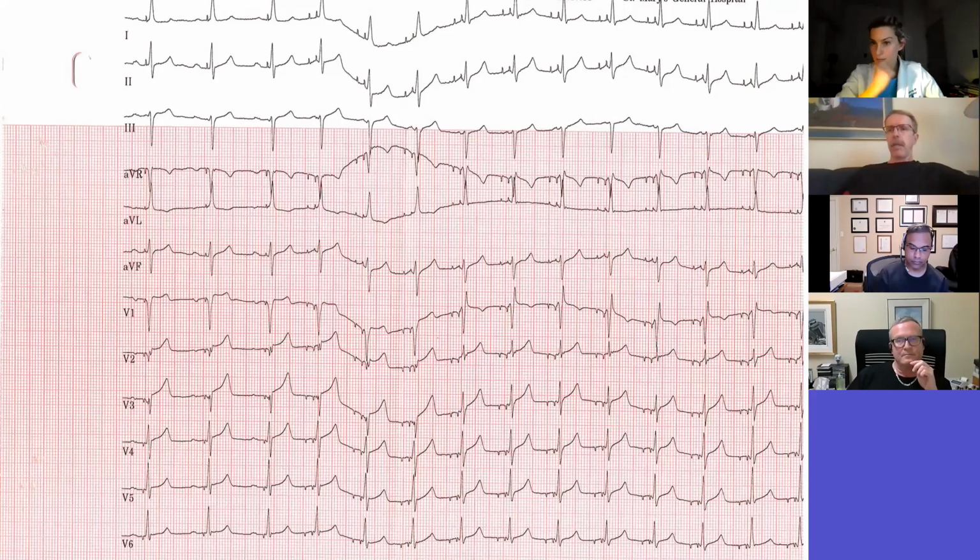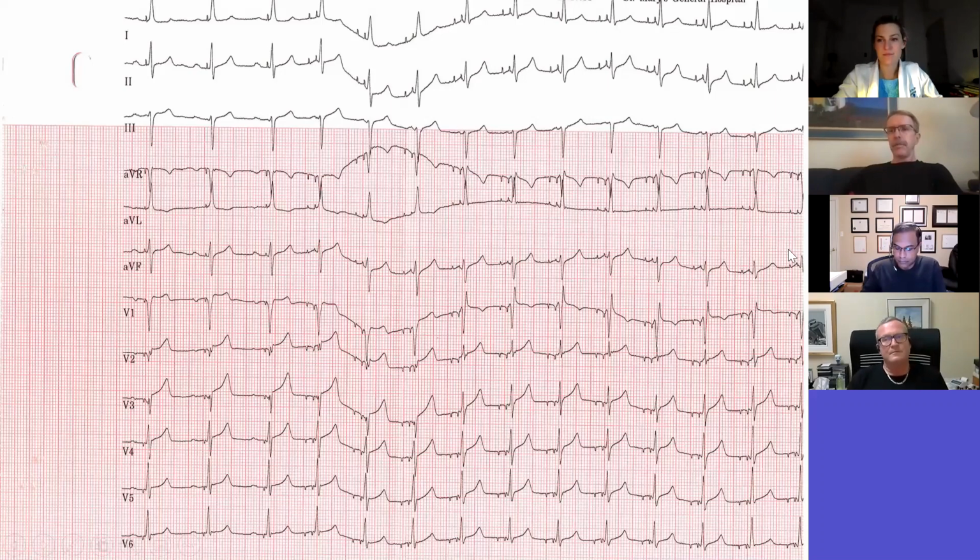So my argument here is I don't think it matters what output you have. It's all the same in terms of the pacing of the heart. Obviously you want to turn it down to save battery, but I don't think having the R prime makes it, quote, better. I agree with you, but I'm saying if your lead is in this position, you're fine because you're capturing the left bundle the whole time.